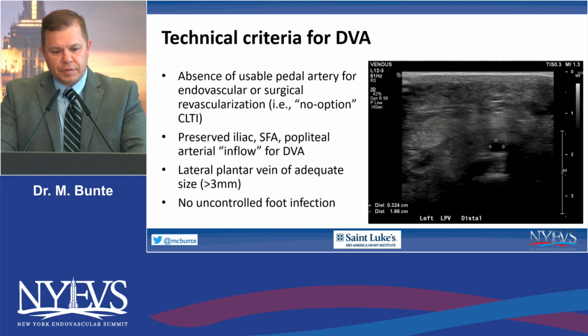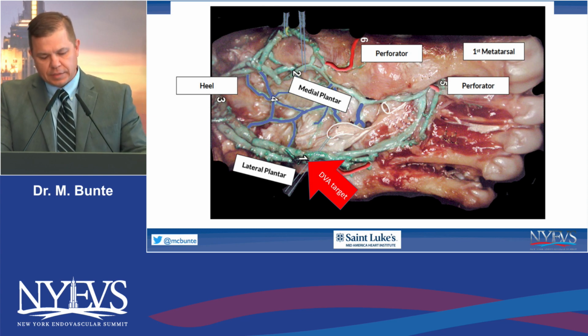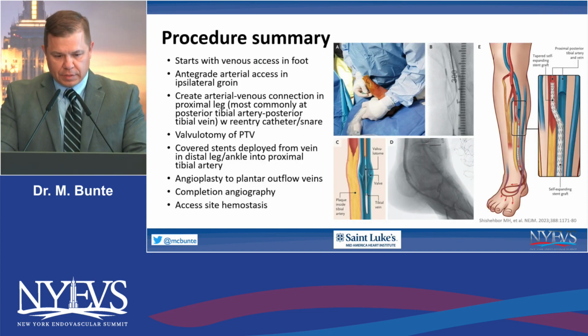The technical criteria for DVA, really just the absence of a usable pedal artery, as I've mentioned, and that lateral plantar vein needs to be at least 3 millimeters to have an adequate place to land your stent. We're going to land the stent in the lateral plantar vein, which is this plantar plexus of venous return in the midfoot. And as you walk, this actually has a peristaltic mechanism to move blood up the leg, so it's a pretty good reservoir for arterial flow once we get it reversed and stented.